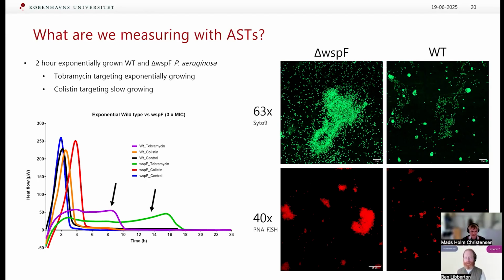Where does that cutoff come from? So I've actually been looking a bit through the literature, but without much luck. And then I decided to test the 20% as you asked about, Tom, but I also tested a 10% cutoff. And I found that, thinking realistically about it, you don't know what species you have in what wells, and sometimes you can have, like, you saw that Pseudomonas produces a lot of heat, and sometimes you can have a little bit of overflow, at least in the version we have, of this energy, which can cause it to look like there's a peak in an adjacent well when there is actually not.